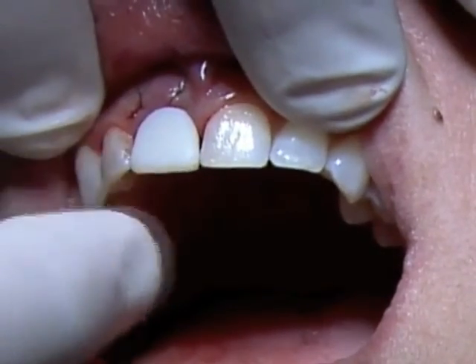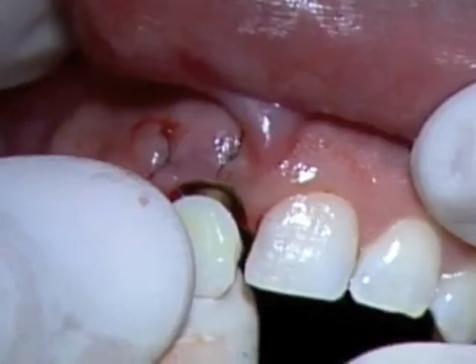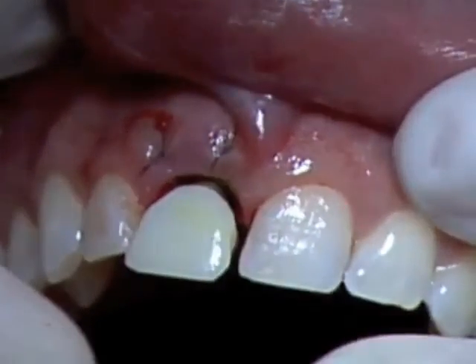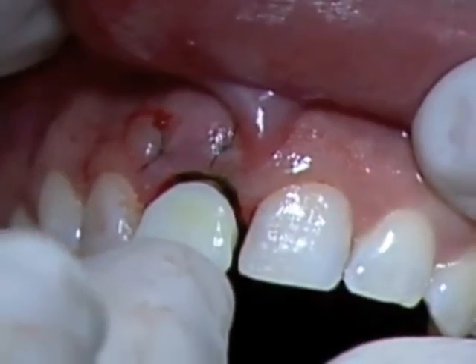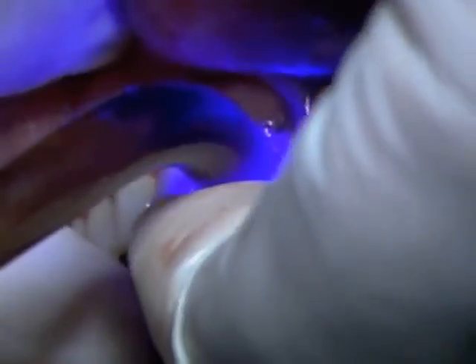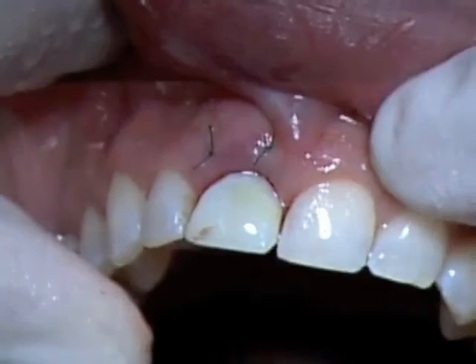We can see it here before we modify it, and after we modify it, we notice how much material we removed in order not to push composite under the tissue. Composite is non-biocompatible, so we like to keep it supragingival.